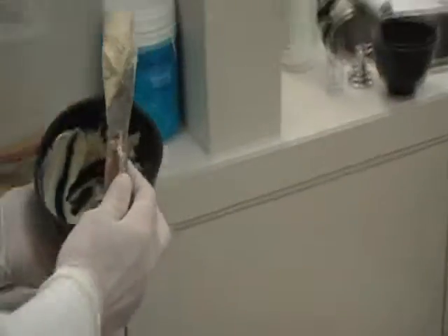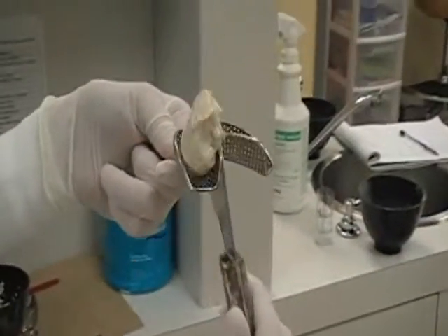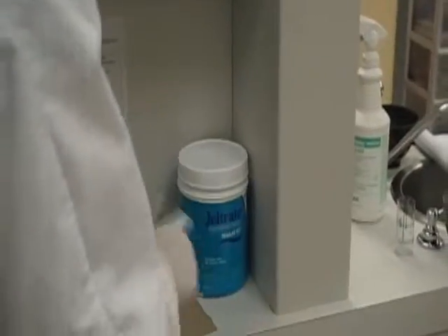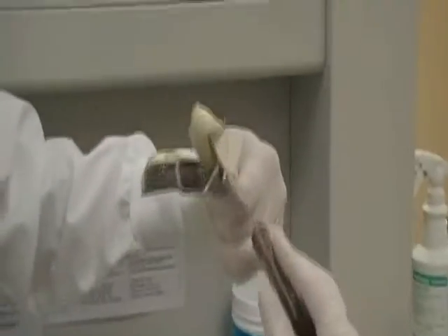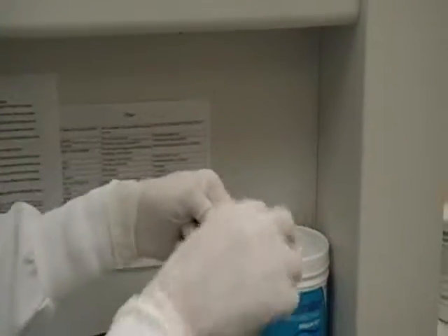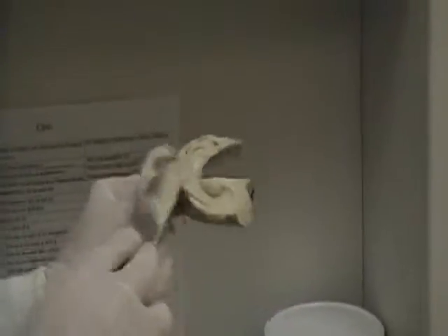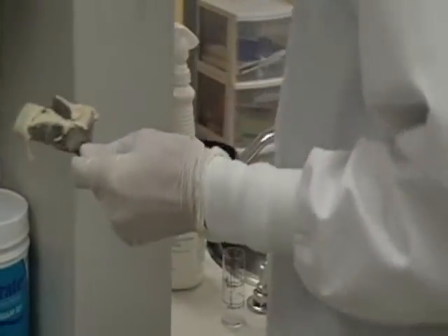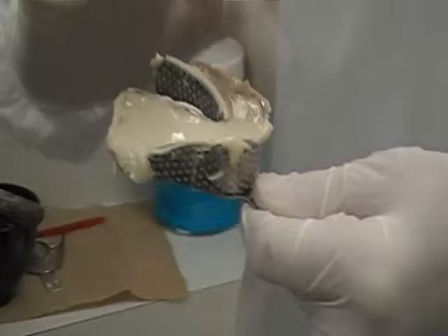You will want to load the lower tray in two increments. You want to load from the lingual aspect — there's one, there's the other. You can add a little bit more if you need to. Then what you'll want to do is get some water and smooth the edge and the very top part.